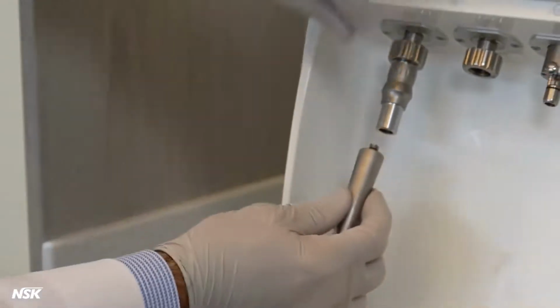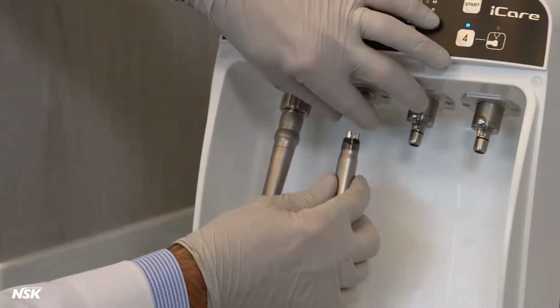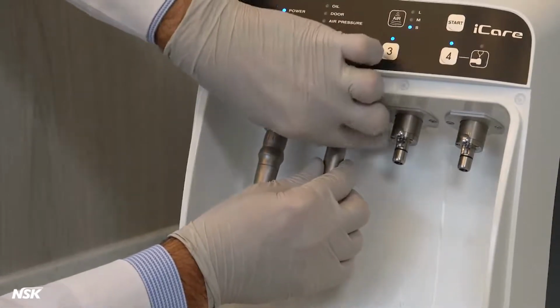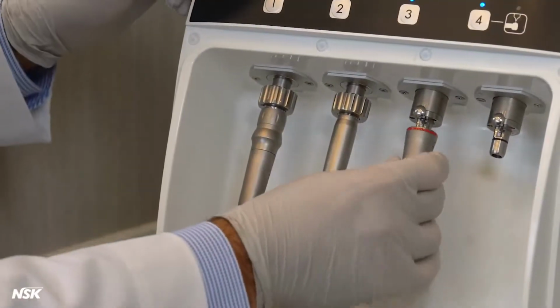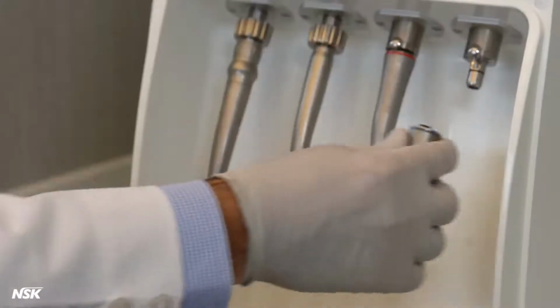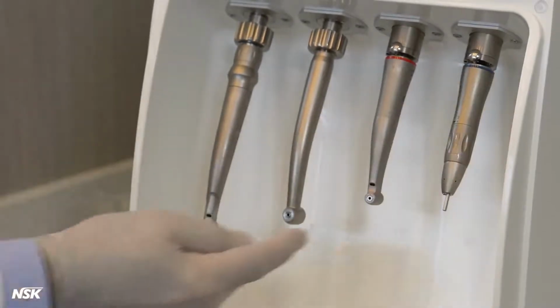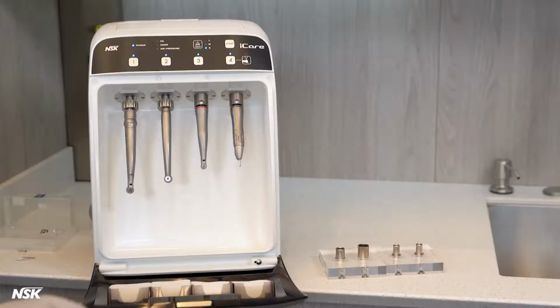Connect Z800L to port number 1 with NSK adapter. Panamax attaches to port number 2 with no adapter just by tightening the screw. This is similar to connecting it into a 4-hole tubing. E-type attachments go into port number 3 and 4. Push to connect with a click sound. All handpieces should face forward toward the sponges on the door to catch the debris coming out of the heads.